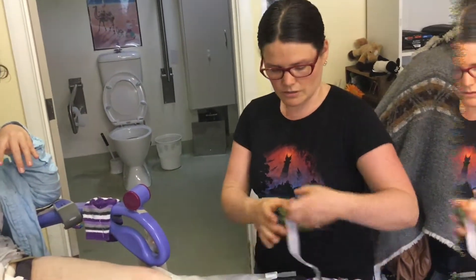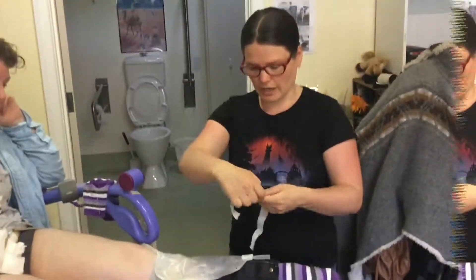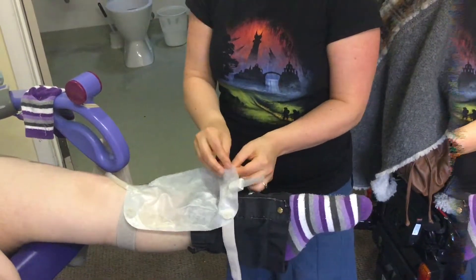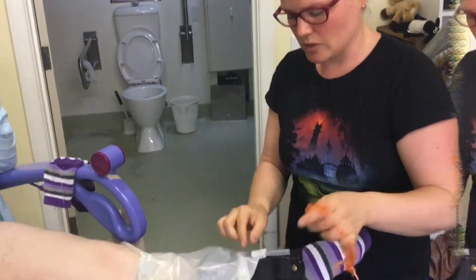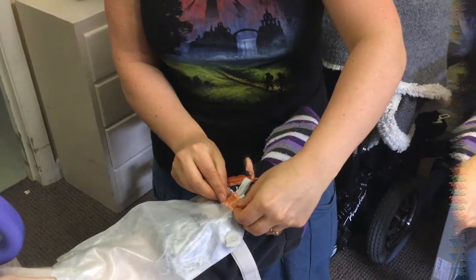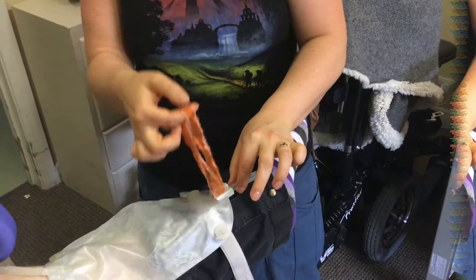The purpose of this is to protect Sam's shoe from getting wet when she empties the catheter bag. There's a smaller strap for the bottom — the buttons go through the little slots in the ribbon. I've just opened the tap a little bit and I'm putting the ribbon in flat like that, so flat like that, and then closing the tap again.